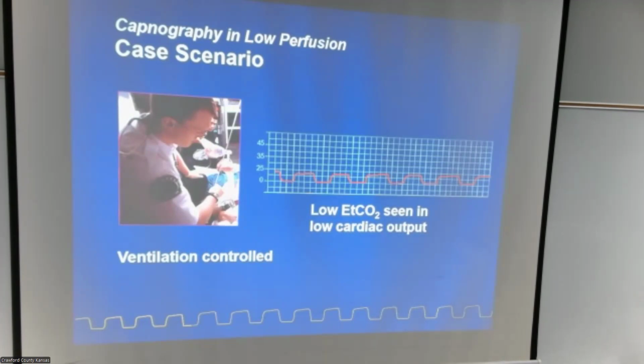What would you do? We can play this two different ways. He has a low end tidal. He's breathing okay, he just has low end tidal. So he's a little hyperventilating.